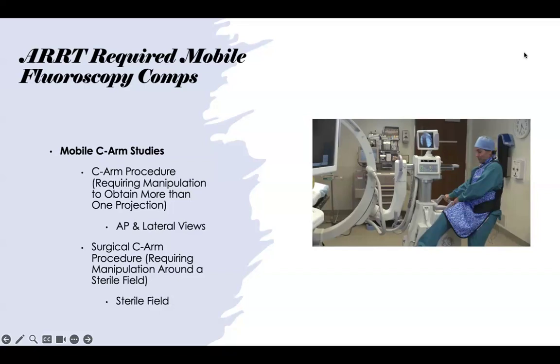Reading through your discussion for last week, I noticed we have a few people that have been able to see fluoroscopy, use it, or just observe, and that's good. But the majority of you guys have not had a chance to experience it. But I would say the biggest thing with using a C-arm is basically just learning how to manipulate it. And of course, whenever you get into your clinical areas or ultimately your jobs, you'll be trained by somebody who probably has been doing it for a long time.